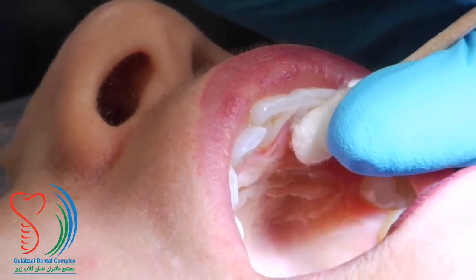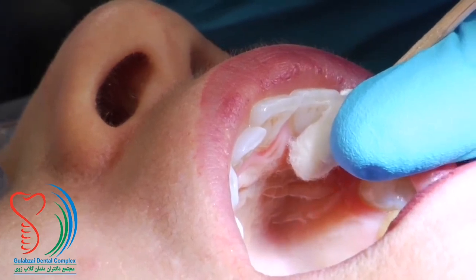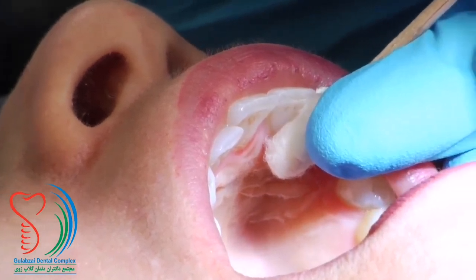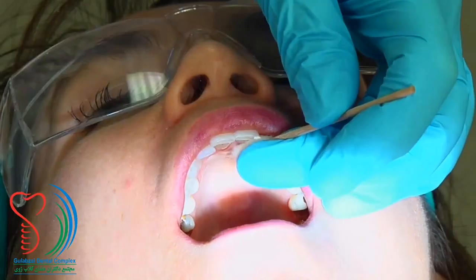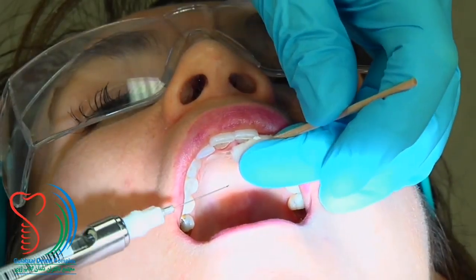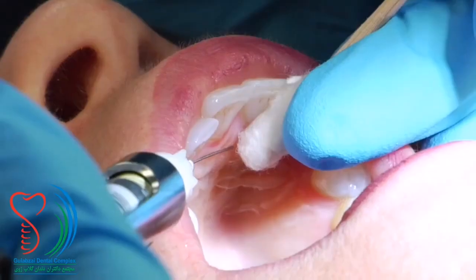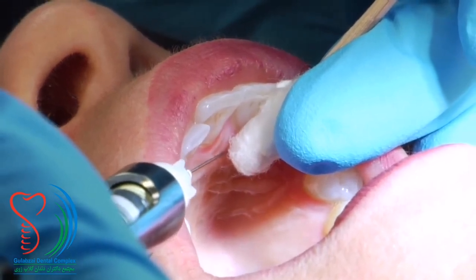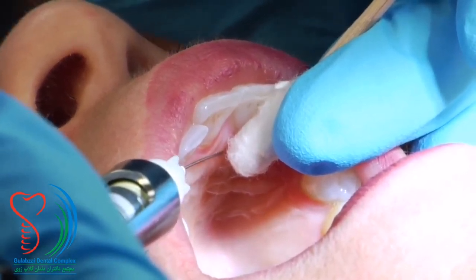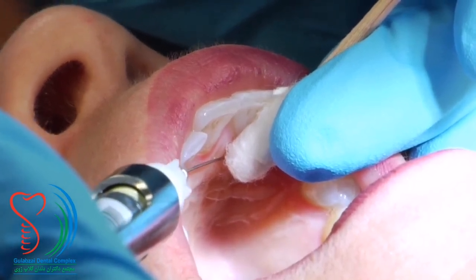After you apply your topical to the penetration site, again with a cotton swab, exert firm pressure to cause some pressure anesthesia, laying the bevel of your needle as close to the pressure point as possible. Do not allow the needle to penetrate the tissue yet, holding a positive pressure on here so you're dispensing a drop or two at a time over several seconds.